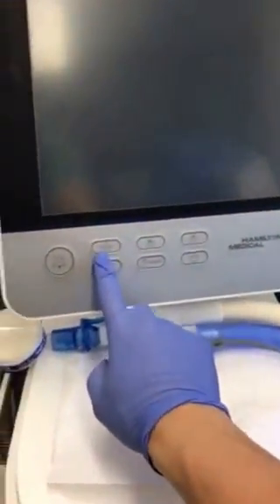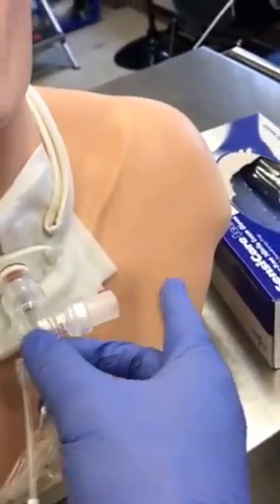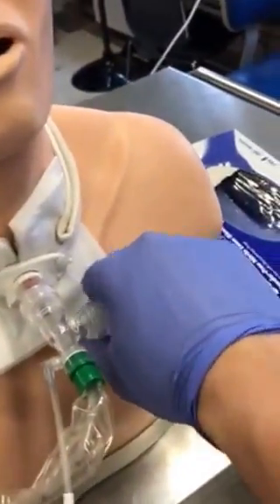This is a Hamilton, by the way. So we're assuming that he has a trach, and this is where the tubing is going to be attached to the ventilator, and then you're going to start up your machine.